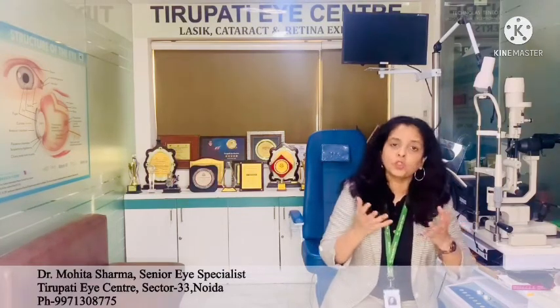But if you are operating on a hard cataract, that narrow lumen should be combined with a flare in the tip so that you are able to cut better. And sometimes these flared tips may have micro grooves. This allows more fluid to go inside, so your fluidics are better and your chamber is rock hard. Similarly, there may be different tubings, high vacuum tubings, lower vacuum tubings, so you need to understand all the functions that are there in your machine.